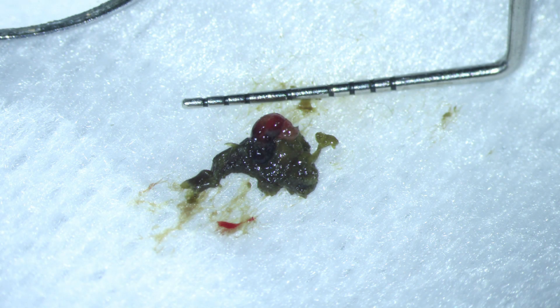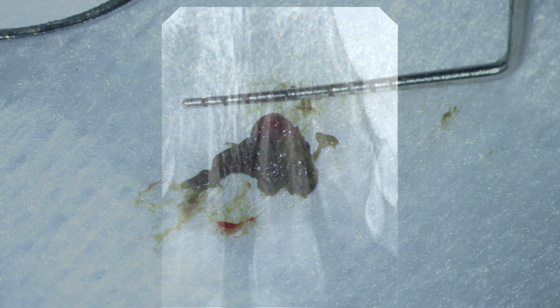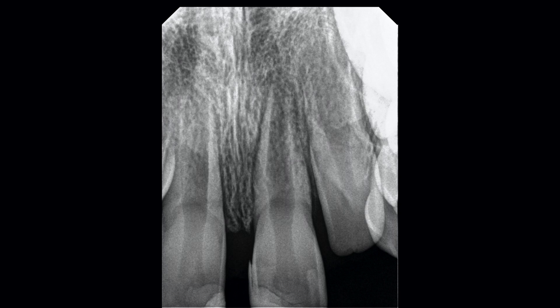The traditional approach to revascularization is usually done in a two-step protocol. The first step is similar to any other endodontic treatment: anesthetize the patient and establish a nice aseptic field. The tooth is accessed, and we remove the necrotic pulp — you can see here what I removed from this particular tooth. That is the etiology, and we've got to get rid of it. It's very important during this process to not instrument the root canal walls. We don't want to touch those walls — they're already thin enough — and we're trying to maintain viable cells that could be left in the odontoblastic layer, which will help in future development of this root.